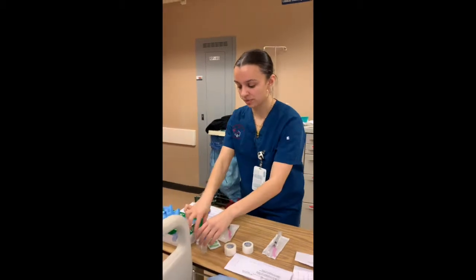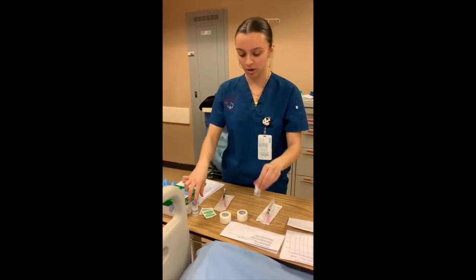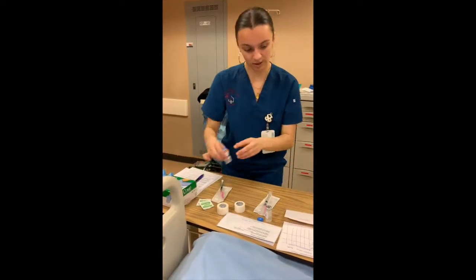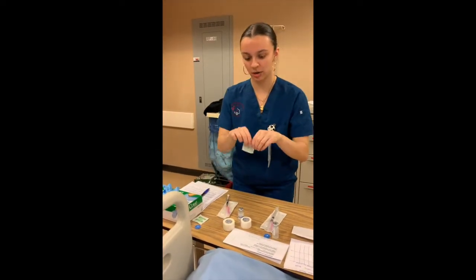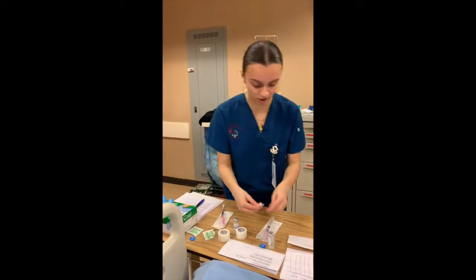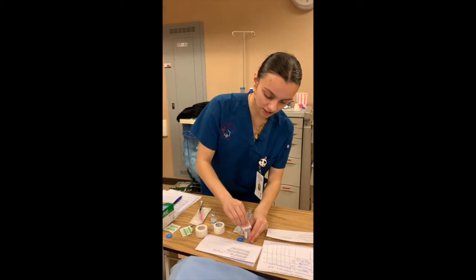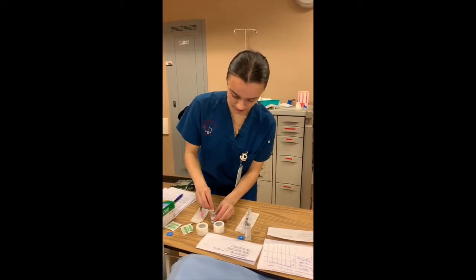So what I'm going to do next, I'm going to take the heparin, and I'm going to take the haloperidol. So this is going to be the haloperidol medication for the intramuscular, and then the heparin for the subcutaneous. So what I'm going to do first, I'm just going to take an alcohol wipe, and I'm just going to wipe it down for approximately 10 seconds just to make sure that the site is clean. Okay.